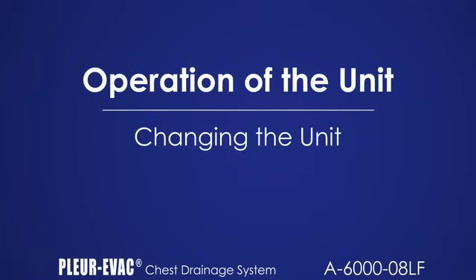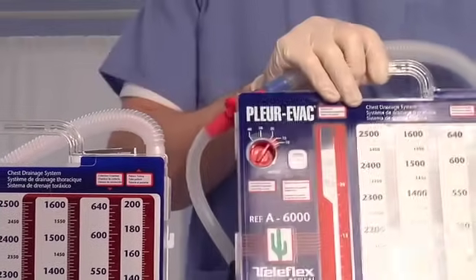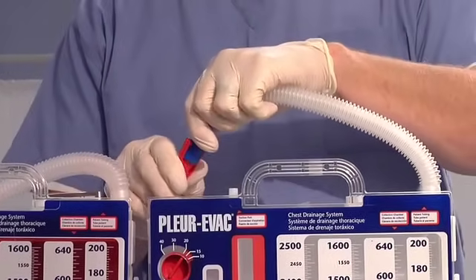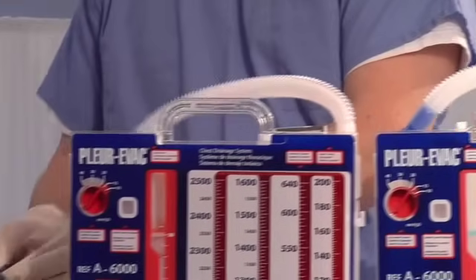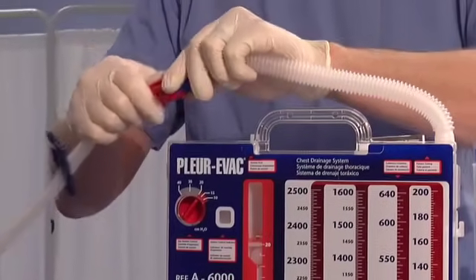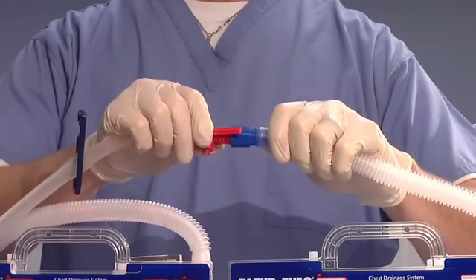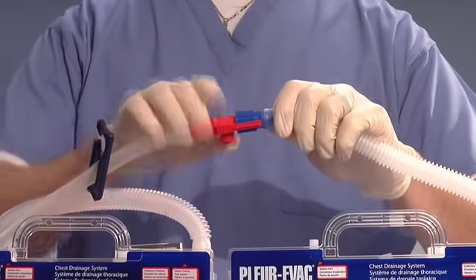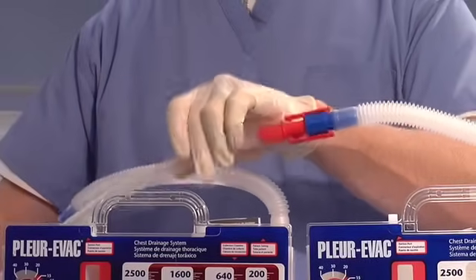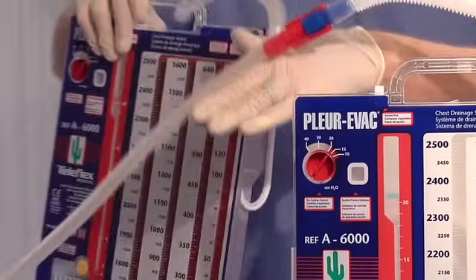To change the unit, prepare the second unit according to setup instructions and place it next to the original Plurivac unit. Separate the red and blue connectors on the second Plurivac unit. Clamp the patient tube on the original Plurivac unit. Separate the red and blue connectors on the original Plurivac unit, keeping the original tubing from the red connector to the patient. Attach the blue connector of the second Plurivac unit to the red connector on the original patient tube. Open the clamp on the original patient tube. After noting the fluid level, discard the original Plurivac unit per hospital-approved aseptic guidelines.